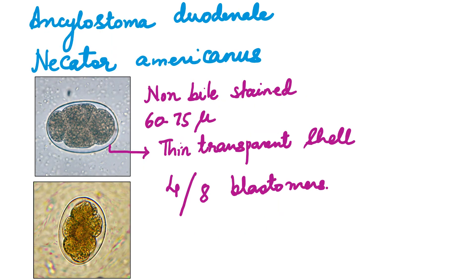Next are the hookworms — Ancylostoma duodenale and Necator americanus. These eggs are non-bile-stained, 60 to 75 microns in size, oval in shape with a very thin transparent shell. Remember Ascaris had such a thick shell — this is very thin. You can see that the ovum has started to undergo segmentation, so you can appreciate either four or eight blastomeres inside the shell. So hookworm eggs: non-bile-stained, 60 to 75 microns, thin transparent shell enclosing four to eight blastomeres.